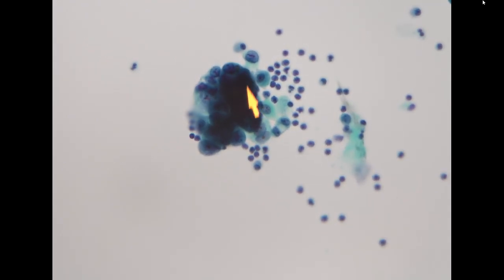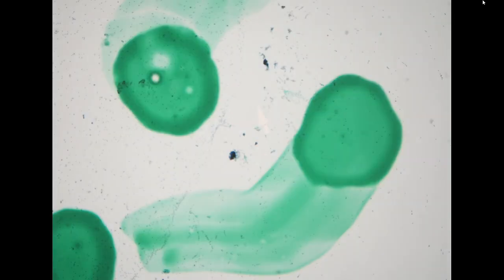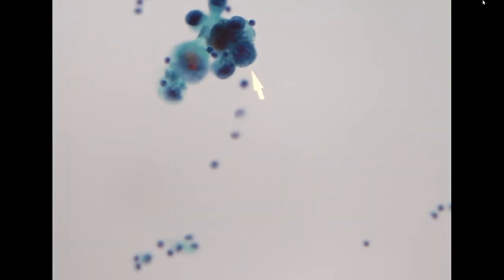So in here, we can definitely appreciate features of high-grade urothelial carcinoma, which are hyperchromasia, enlarged nucleus, coarse chromatin, increased NC ratio, and so these cells definitely look like high-grade urothelial carcinoma. So in this pleural effusion specimen, we call it positive for non-small cell carcinoma. And given the patient's prior history of high-grade urothelial carcinoma, this is compatible with metastatic urothelial carcinoma.